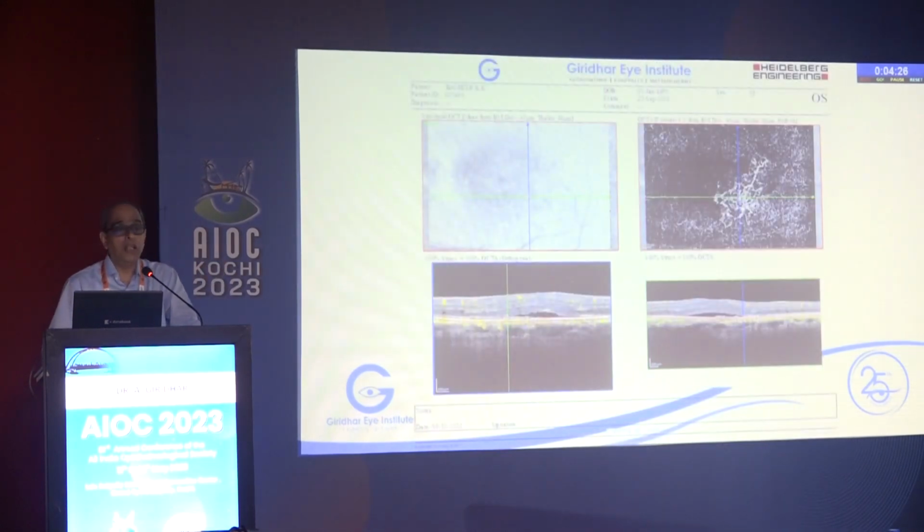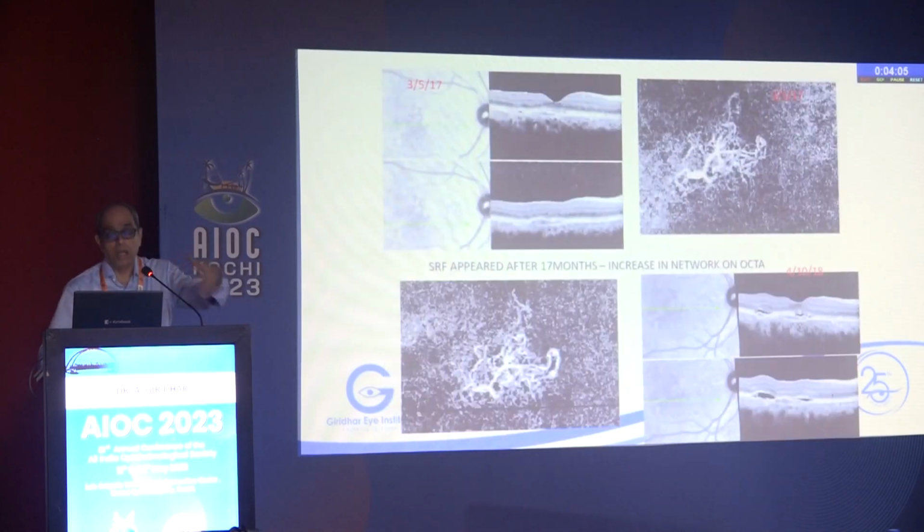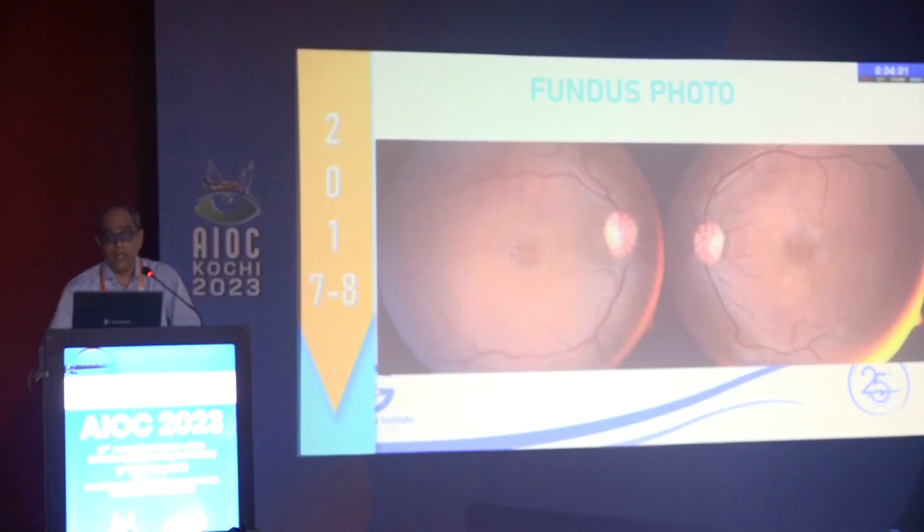But then finally we did an OCTA because we thought that it could be a CNVM because of the age. So, OCTA shows a neovascular network. So, in elderly patients, we use multimodal imaging like this. Although the other tests were not conclusive, we do the OCTA. Nowadays, we do it early. But what I mean to say is the stepwise use of multimodal imaging in this.